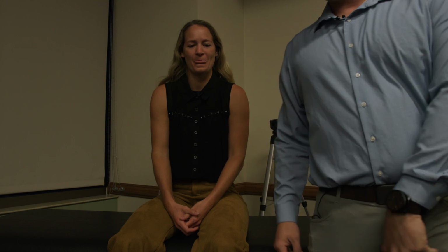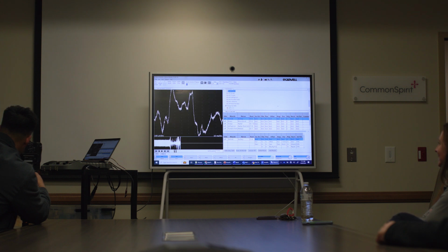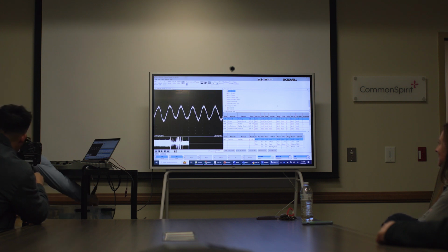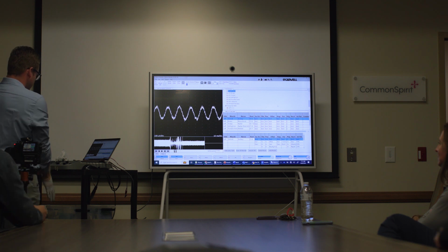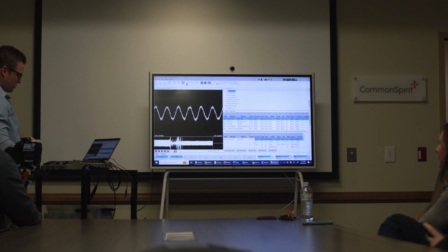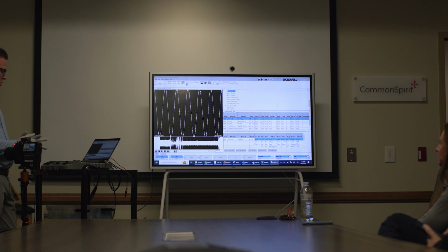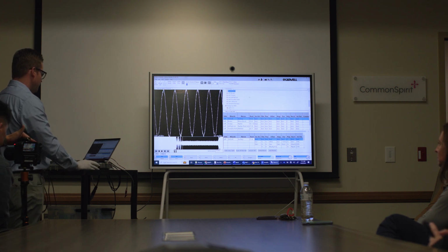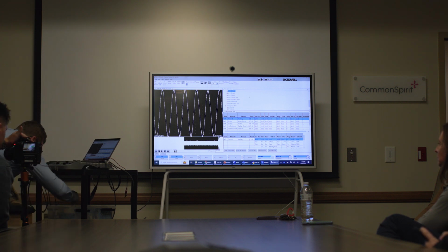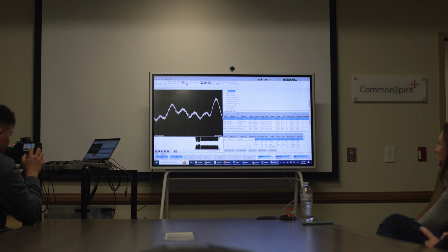All right, well, let's switch gears to the EMG portion. You can come on back down there. Get this underneath you again. And then the way I describe this part is with a tiny needle electrode. It's about acupuncture size. We'll go into some of the muscles and listen to the electric activity in your muscles. Some of them you might not even feel. Some of them are a little bit tender. And then you can just rest your hand right there. Check out a few arm muscles here.